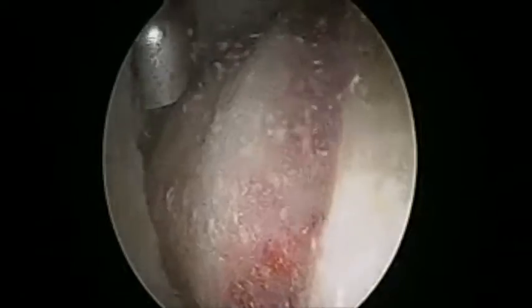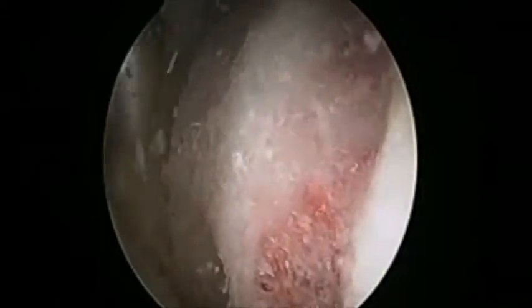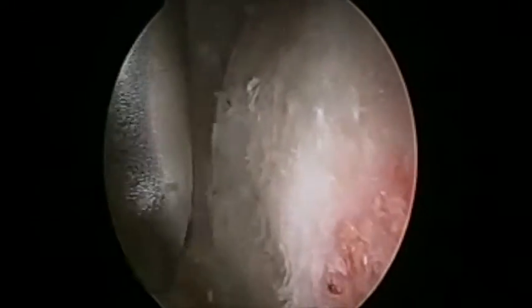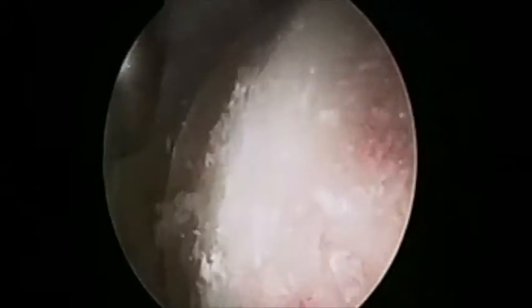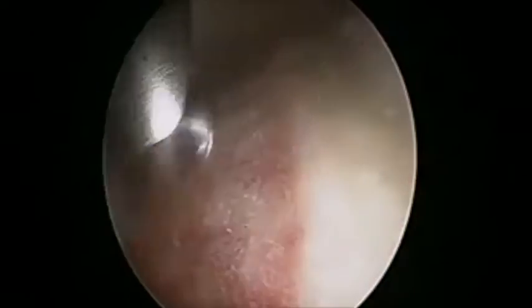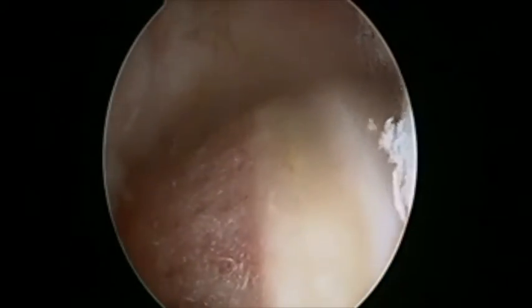After satisfactory resection of Tier 1, attention is then turned towards the remaining cam distal to the first tier. The goal is to match the depth set by the first tier. This is accomplished with a consistent sweeping motion with the burr on reverse to allow for greater control and minimize risk of over-resection. At the completion of the Tier 2 resection, attention is turned to the femoral neck proximal to the first tier. Here the burr is utilized again to recreate the sphericity of the femoral head.